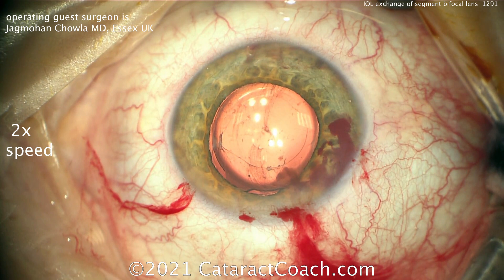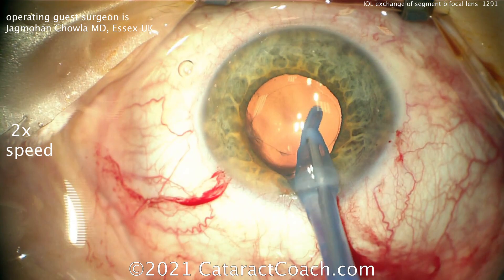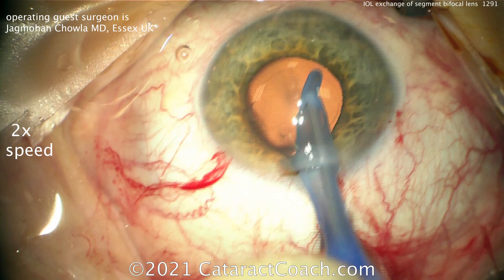That looks great — now just finish up the case: take out the viscoelastic, put a suture in if needed, and you're done. Very nice case of IOL exchange from Dr. Chawla. Keep in mind you can't cheat physics — if you want the absolute best distance vision and the absolute best nighttime driving vision, you're not going to have the near vision, at least not with current technologies, until we have a truly accommodating IOL available for everyone.